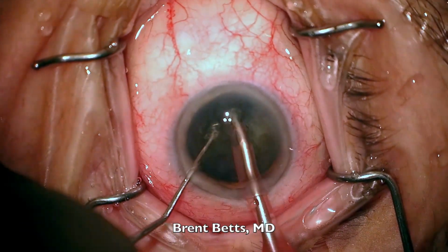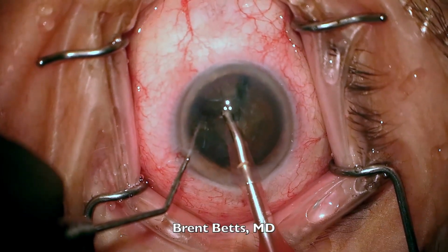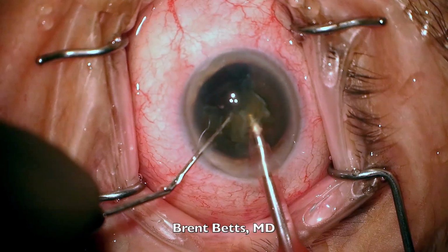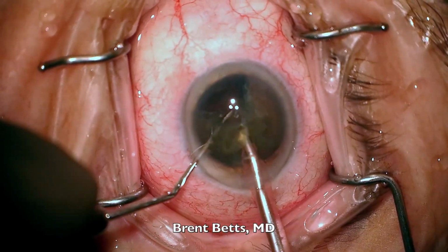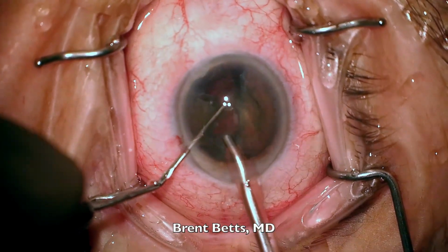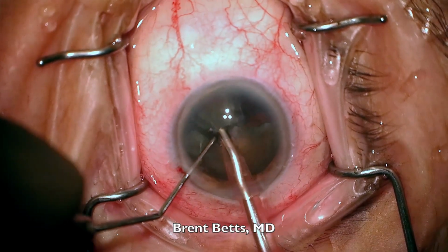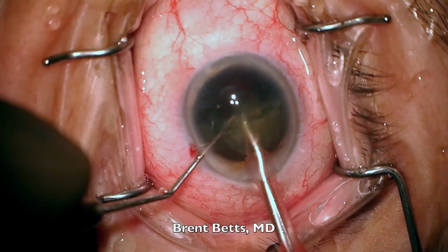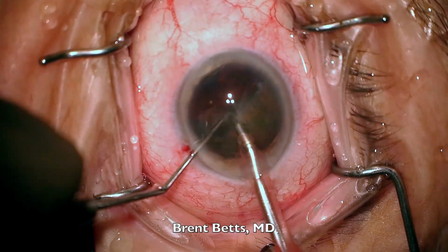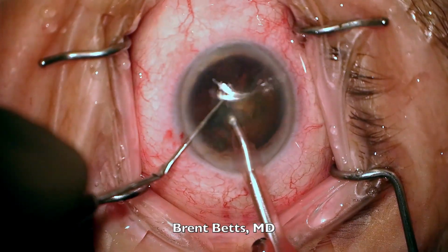The second instrument, which we call a chopper, in this case a Nagahara chopper, aids me in breaking the cataract into smaller pieces. It also helps protect the posterior edge of the capsule, which is only 10 to 13 microns thick. It's easy to break, and if it breaks, you will see vitreous in the front chamber of the eye, which is a complication of surgery. One of our goals in cataract surgery is to never break the posterior capsule.